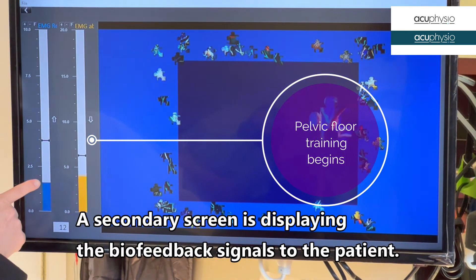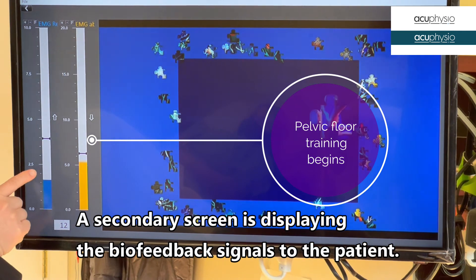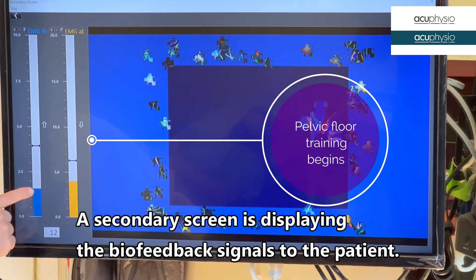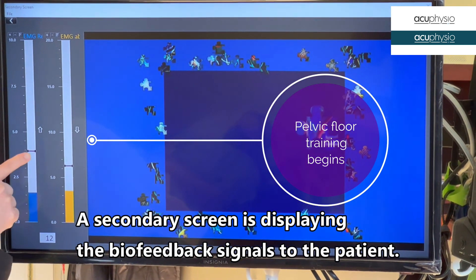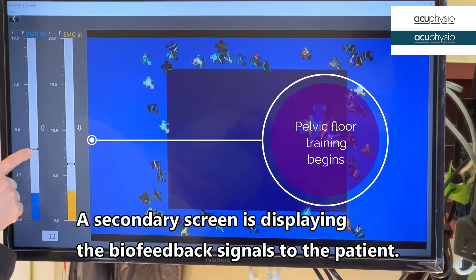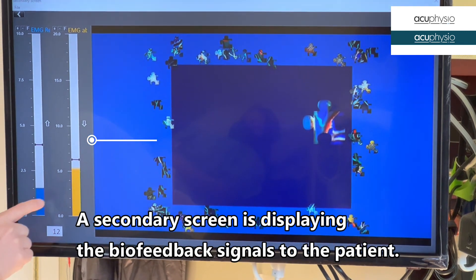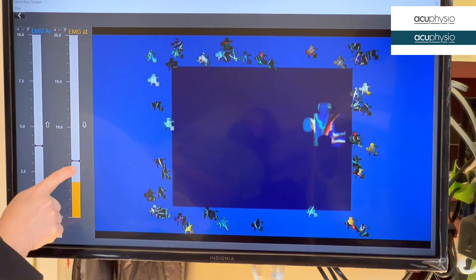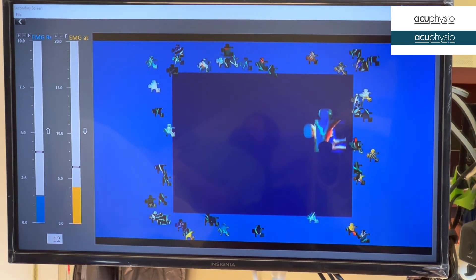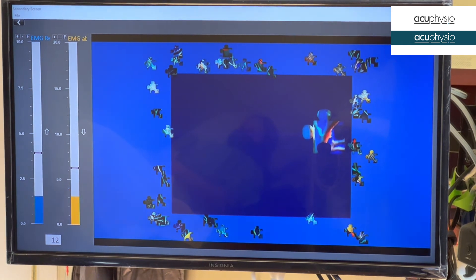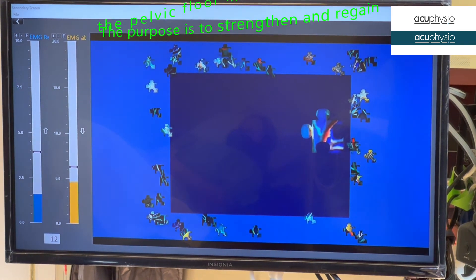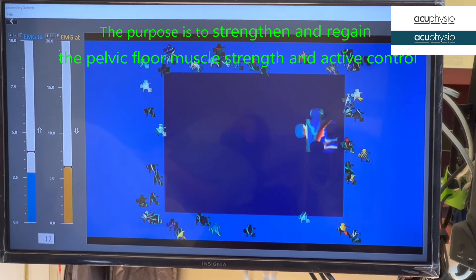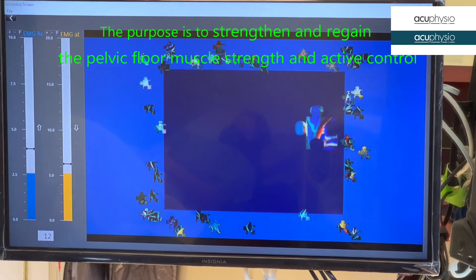I want you to contract your pelvic floor muscle and bring this one all the way above the blue bar. At the same time, I want you to relax your abdominal muscle. Contract. Relax.